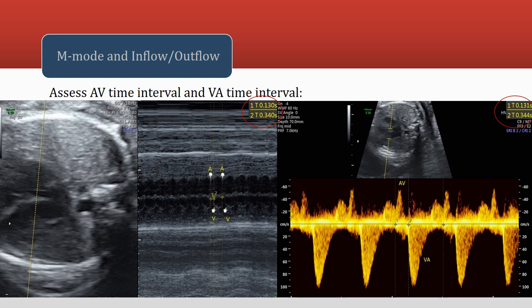Here is a quick example of the normal M-mode and inflow-outflow images with measurements of the AV and VA intervals. These images were taken on the same fetus, and you can see that the intervals are measured and you're getting similar measurements on both images. When we can reproduce an image, we can really prove that we have properly assessed the fetal heart rhythm.